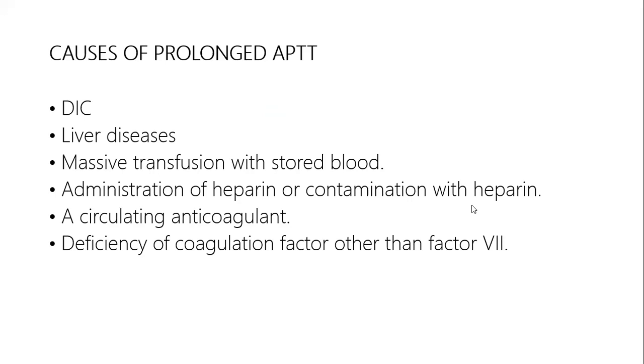That's why we don't recommend using the heparin green top tube in venipuncture collection of the patient's blood sample, because traces of heparin will really affect the patient's APTT.